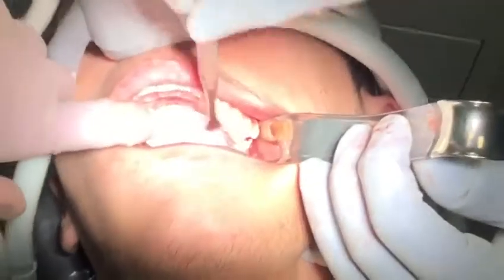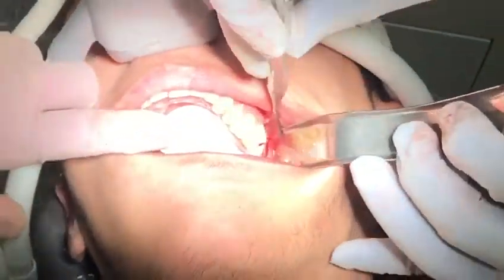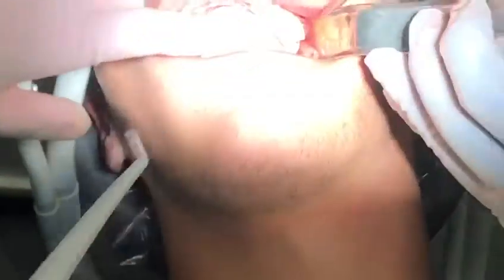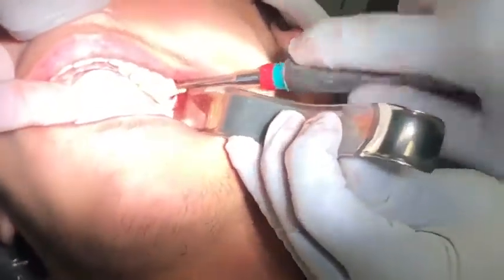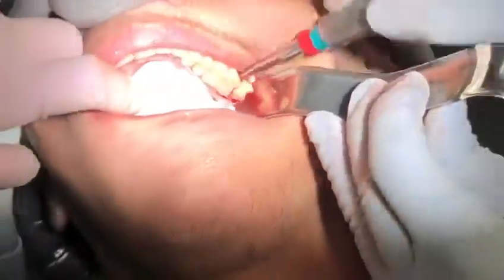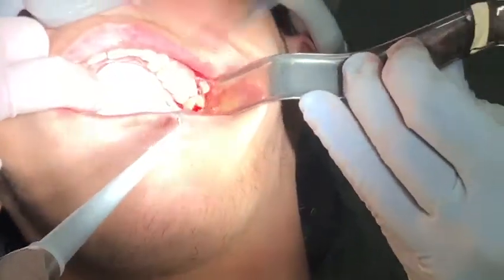There's a little net to catch the tooth — it tries to escape the wrong world. Let's see, that's okay, no problem, a little pressure moment. Let's see, a little pushing — there you go, good stuff.